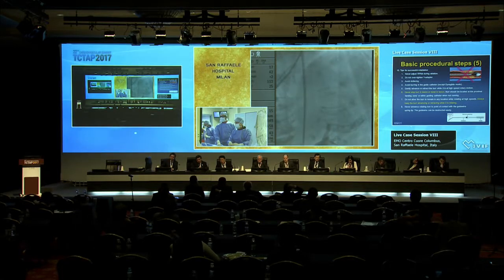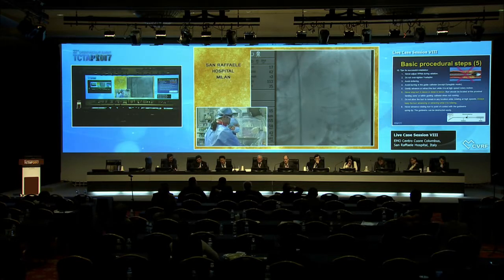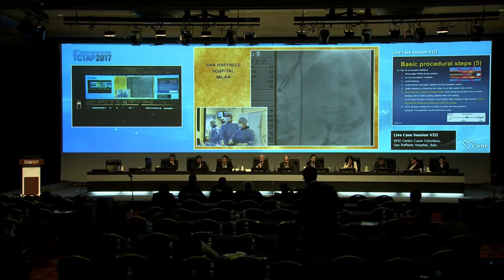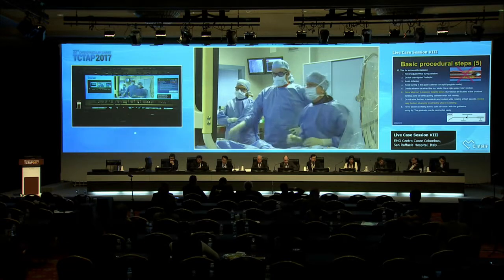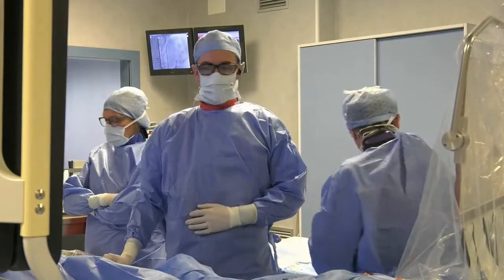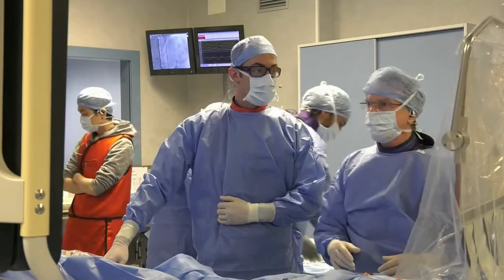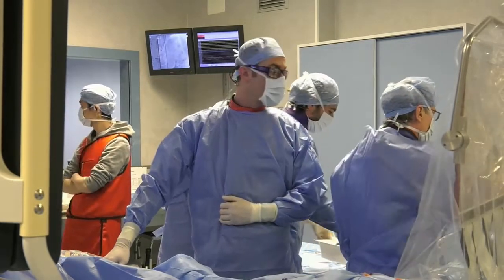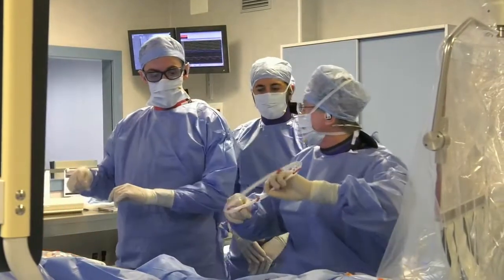Despite having dilated. No, we go down. Okay. Can I have a Grand Slam wire, please? Okay, yeah. What we do, I think we need better support from the guide, which will always be welcome. So we place a Grand Slam in the LAD, or in the circumflex is better, in the LAD to get better guiding support, because we have to go down also with a 2.5 balloon.